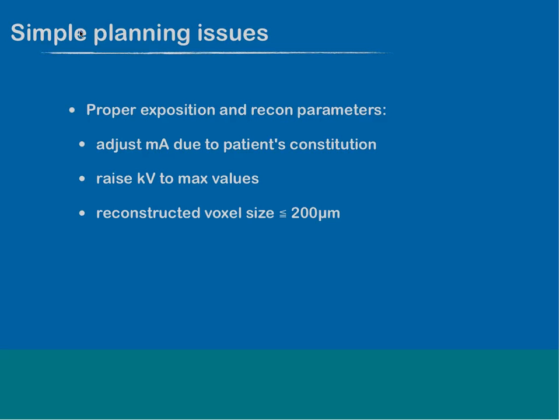Reconstruction should generate voxel sizes below or even to 200 microns. So any kind of geometric problem can be avoided with regard to the reconstructed voxel size. So just secure that your voxel size is not larger than 200 microns.